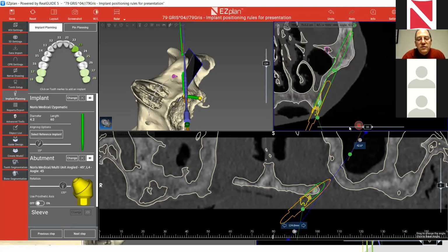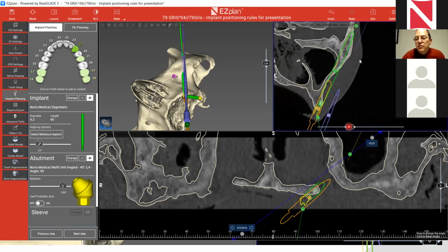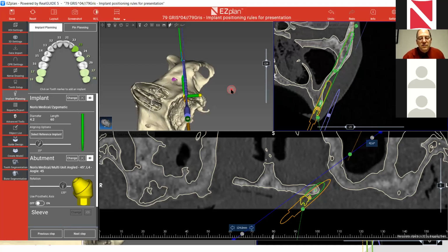Okay, look, I'm looking now at the sinus angle. We found the sinus angle to the implant. That's exactly what we wanted to do. So this is a tool that one has to practice until you really know how to work with it. But it is a measurable tool that can assist this very important measurement.